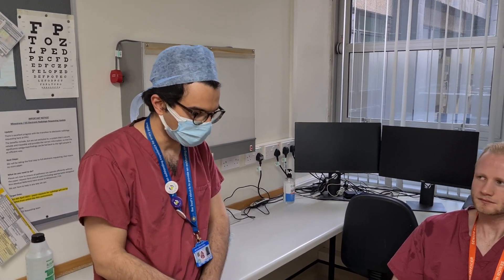Hello there. Today we'll be showing you how to perform a flexible nasal endoscopy.